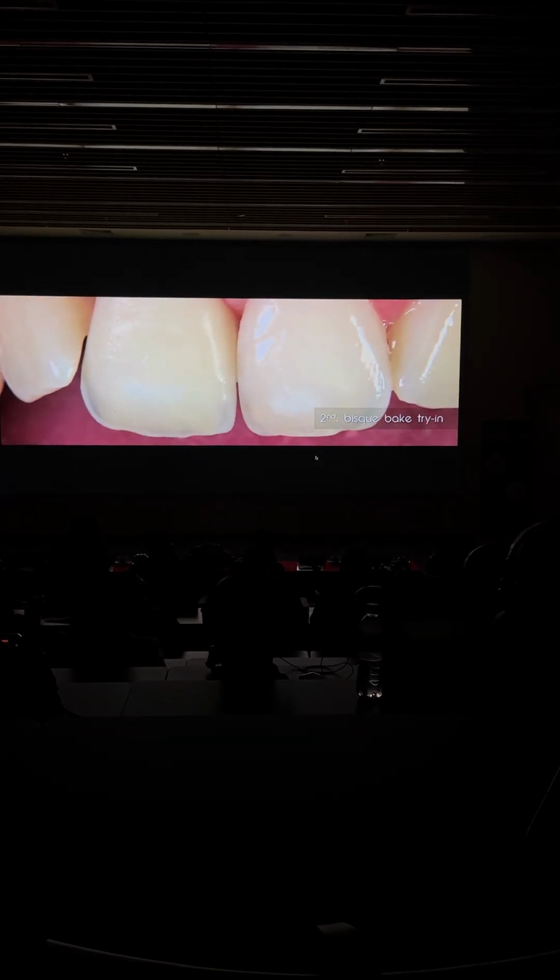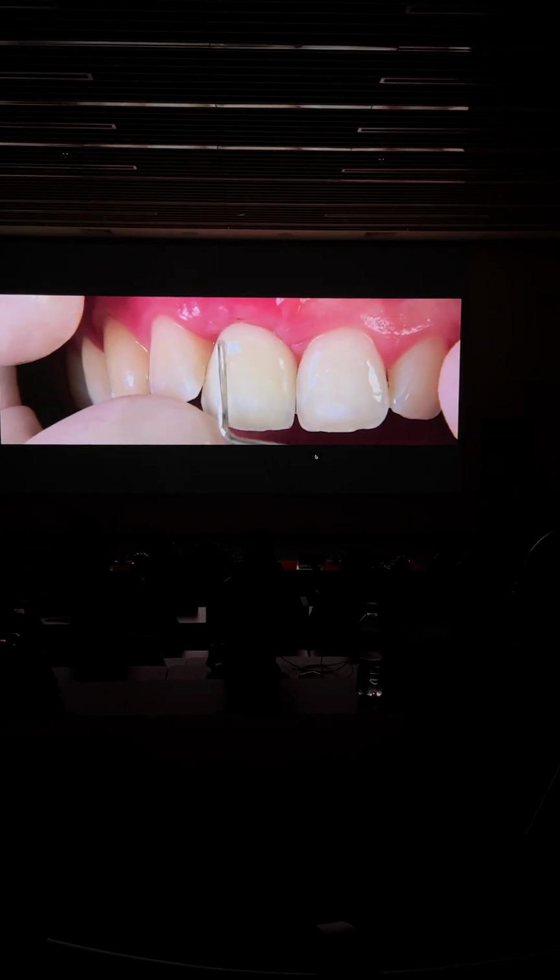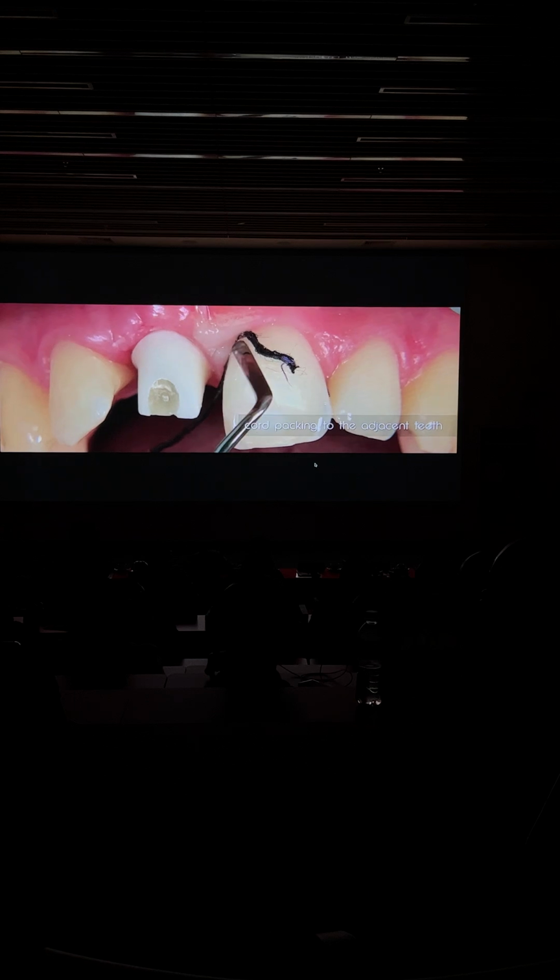Now you are way too dentinous, too much chroma. I like the contact point. I will add some composite on the adjacent tooth. You put too much tissue. So I start modifying everything he has done. I need more contact point on the distal, and then on the glaze he tries to compensate everything, add contacts, and then modifying the final crown to finish the case.